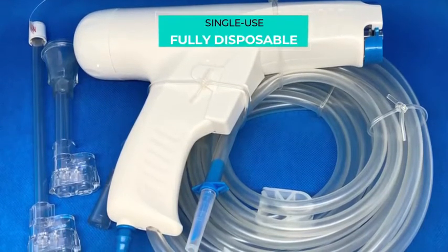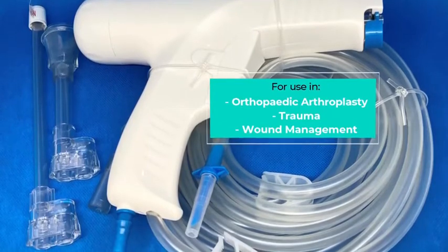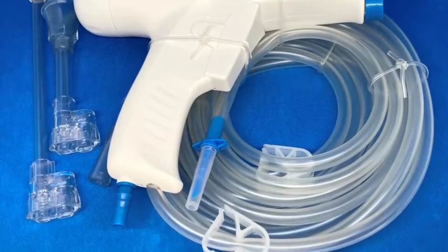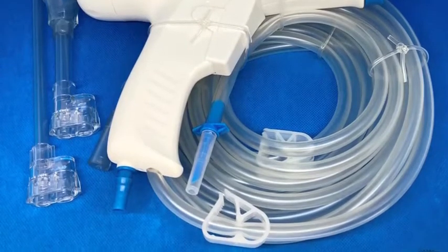This single-use, fully disposable device is designed for use in orthopaedic arthroplasty, trauma and wound management procedures. For wound management, the system facilitates quick and effective removal of any necrotic tissue, bacteria and foreign bodies from the wound area.